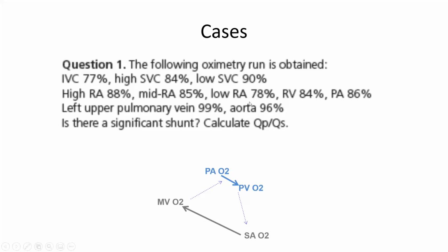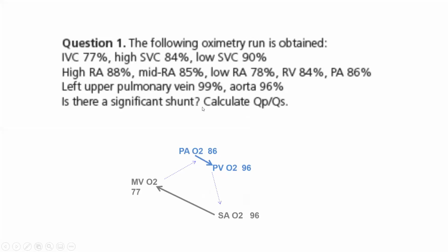And I think in this case, the aortic sat is a better representation of the average of the 4 pulmonary venous sat. I think if you sample another pulmonary vein, it may be 95%. And this is kind of the average of them. So in that case, just because I know there is no right to left shunt, and the O2 sat is high, the systemic sat, I would rather use 96 rather than 99 for the pulmonary venous sat. Okay, you kind of get the idea, because this is only one, not the 4. I think if you average the 4, it will come up 96%.